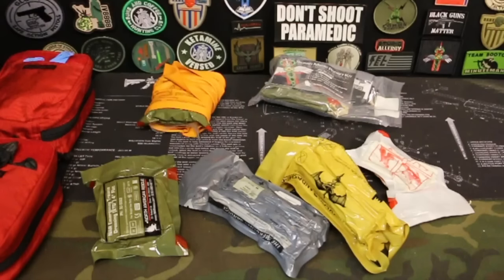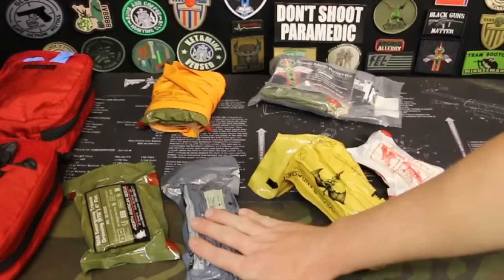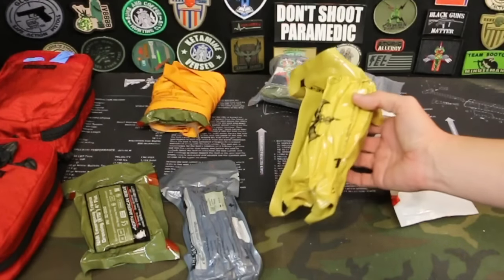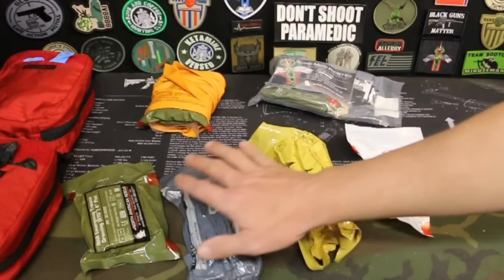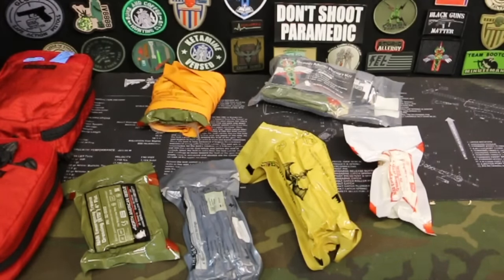The next thing you're going to see that these kits have in common is a pressure bandage. There are plenty of pressure bandages on the market, so find one that you like and go with it. This is the one made by North American. This is an Israeli bandage. This is an Olaes bandage made by Tac Med Solutions. This is a First Care bandage — I haven't done a video on it yet but I need to. They all do the same thing with a little bit of difference, but you need a pressure bandage in there.